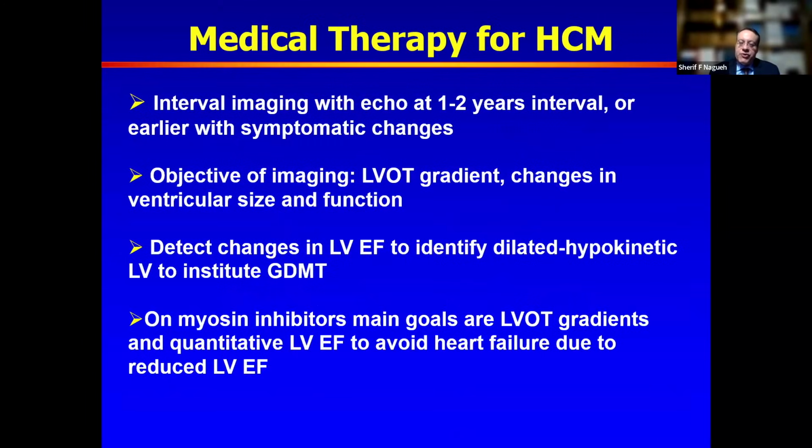We want to look at changes in ventricular size and function. As you saw, a small subset can develop the dilated hypokinetic phase of the disease, which dictates a different type of treatment with guideline-directed medical therapy for patients with heart failure reduced EF.